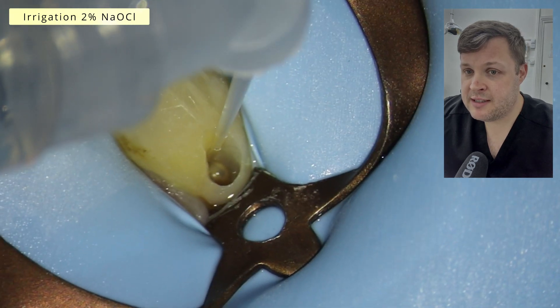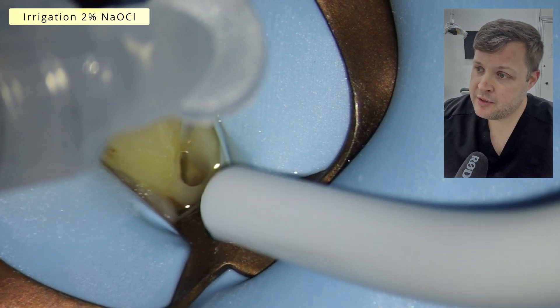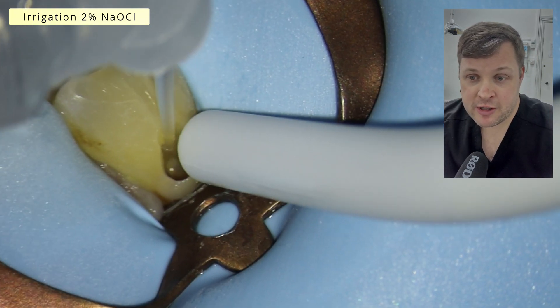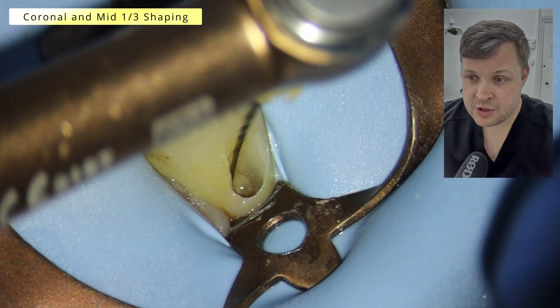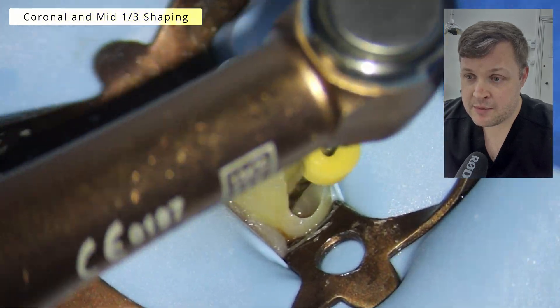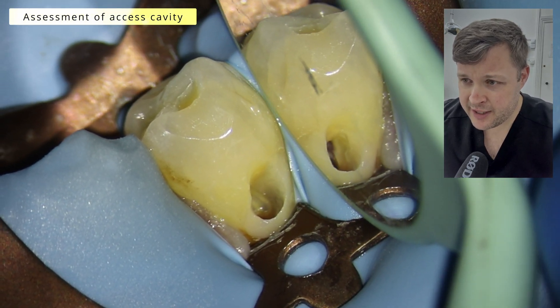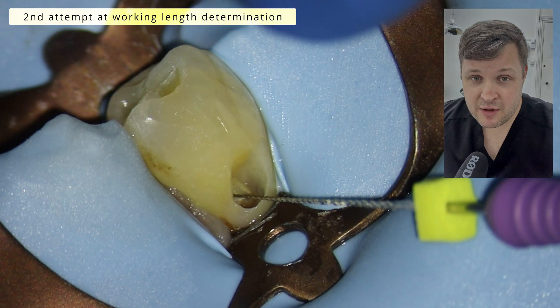I'm going to use these rotary files to shape the tooth. I'll measure the rotary file and make sure it's about one to two millimeters away from as far as I could get with the hand file, with lots of irrigation. This rotary file is a 1503 HyFlex. I'm just opening up the coronal to mid third, and as you can see the access to the canal itself is opened up a bit more.